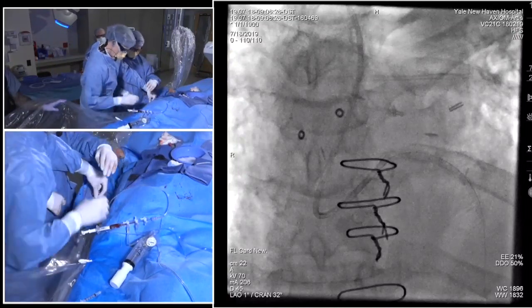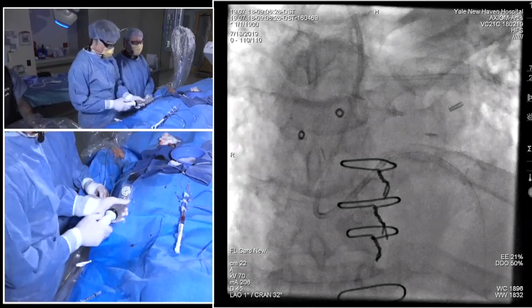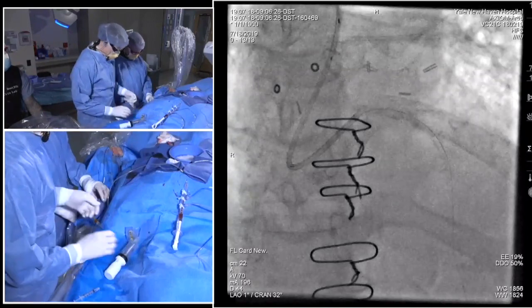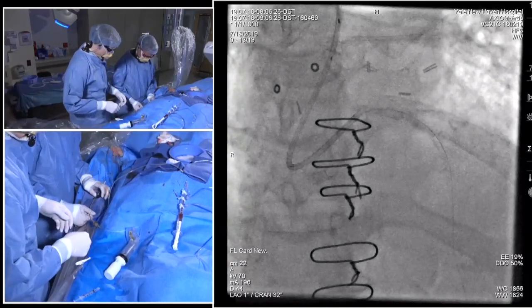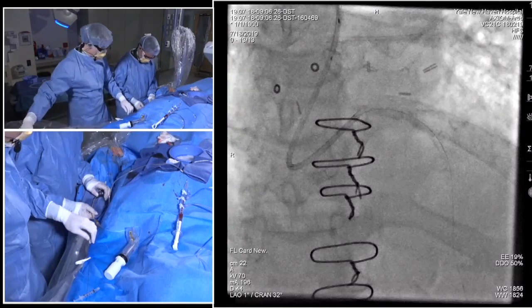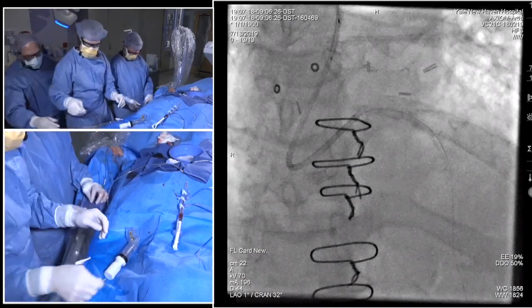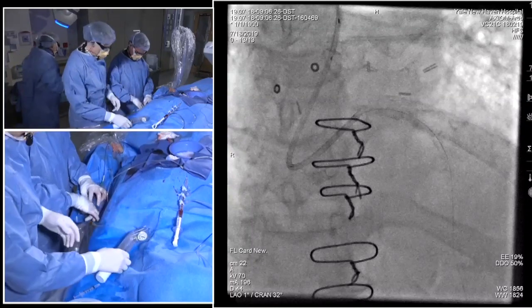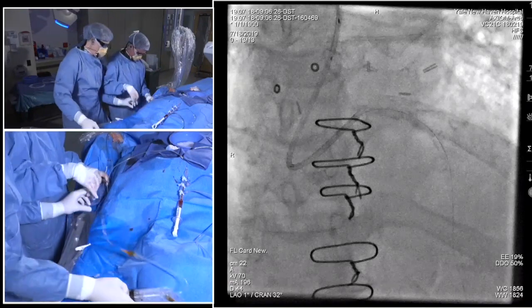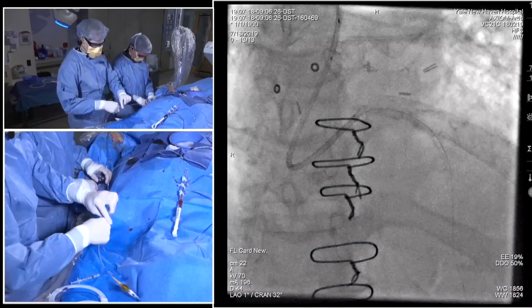So, Ajay, I'm just curious, in cases where it's maybe a borderline case about whether you're going to use hemodynamic support or not, do you do any intra-procedural monitoring just to follow hemodynamics other than just their systolic pressure? I don't routinely put in right heart caths to monitor, but in a case where it's maybe a borderline indication for hemodynamic support, it may not be an unreasonable thing to be following their PA pressures or their wedge, because you may see some changes there before you start seeing changes in the systolic pressure.